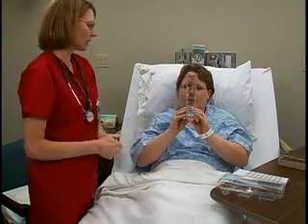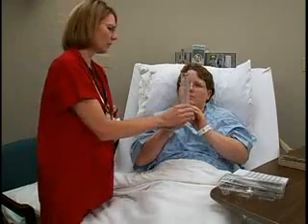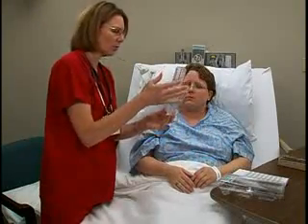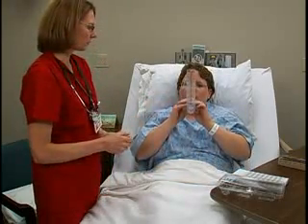Don't put it on the floor. Now have her blow out as hard and fast as possible through her mouth. I want you to blow as hard and as fast as you can. Blow really hard. Good. Let me see what we got. Check the PEFR measurement and repeat the process again 2 more times, recording only the highest number on the patient's chart. Try to get the best one out of it.